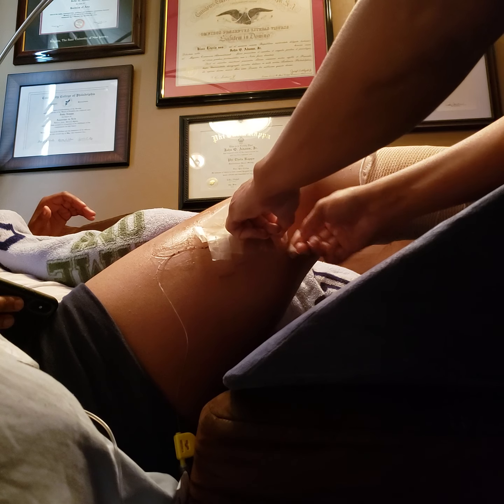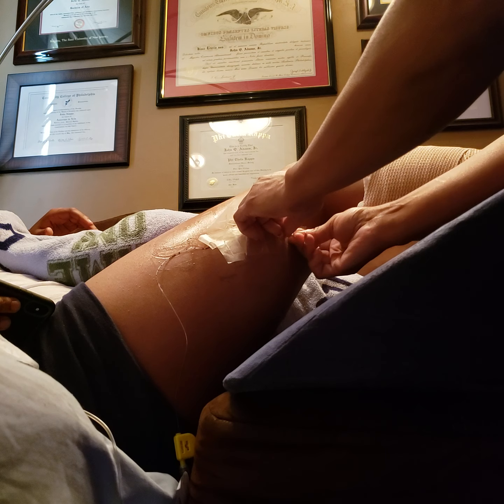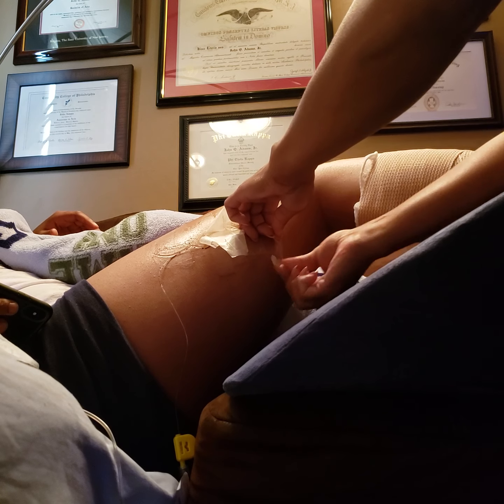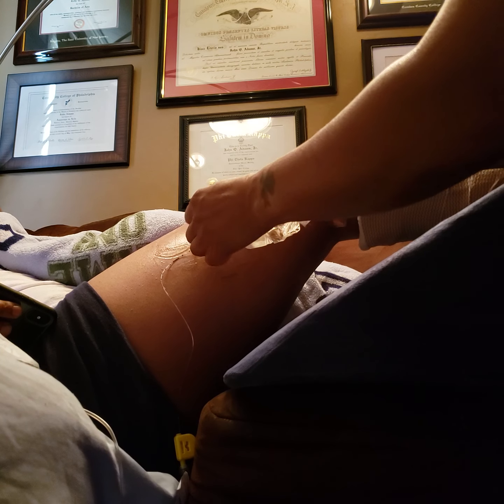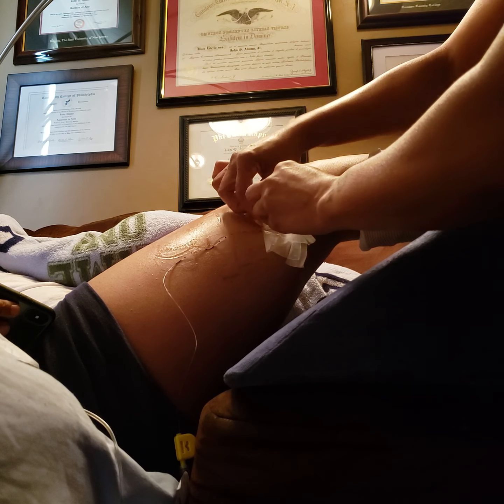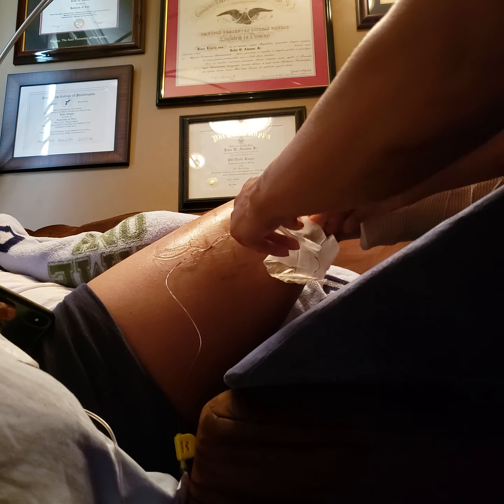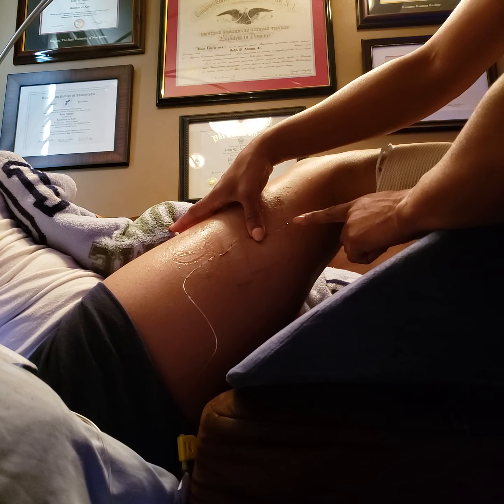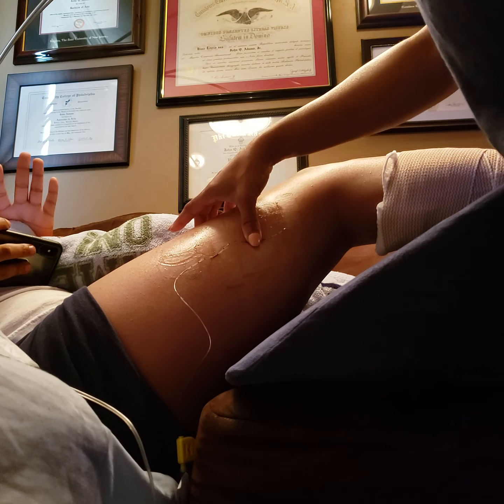I'm almost done — this is just the tape left. The catheter itself — I don't think you would feel that at all. Just be careful when you're removing it because you're messing with a nerve. Okay guys, so that's the insertion point. When I pull, I'm going to pull gently and downward. Just do it quick — don't announce it if someone has anxiety.